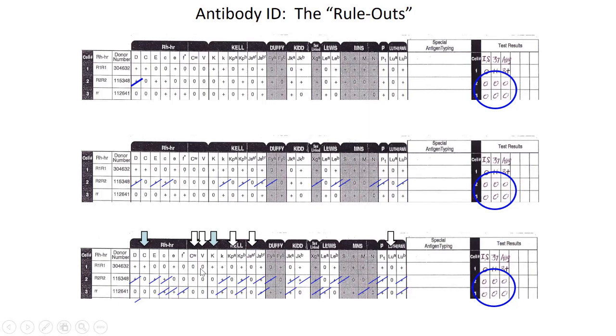They just weren't there to detect what antibodies your patient may have had. The blue arrows are again showing what the leading suspects are for this reaction panel. You're really just left with big C or Kel as far as what you can potentially rule in.